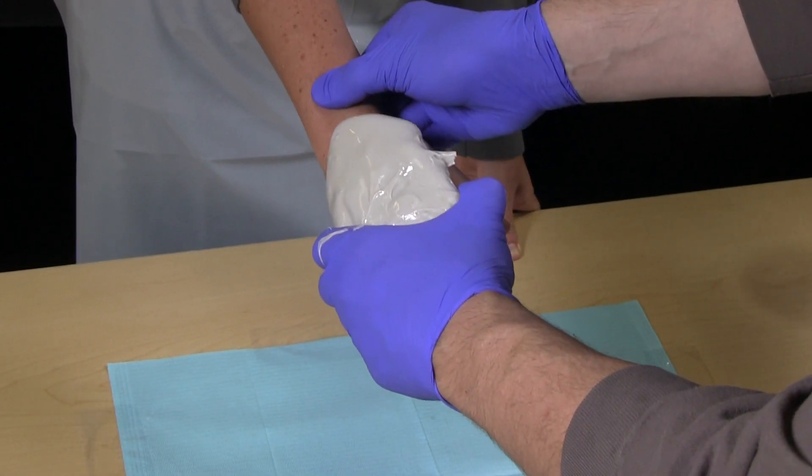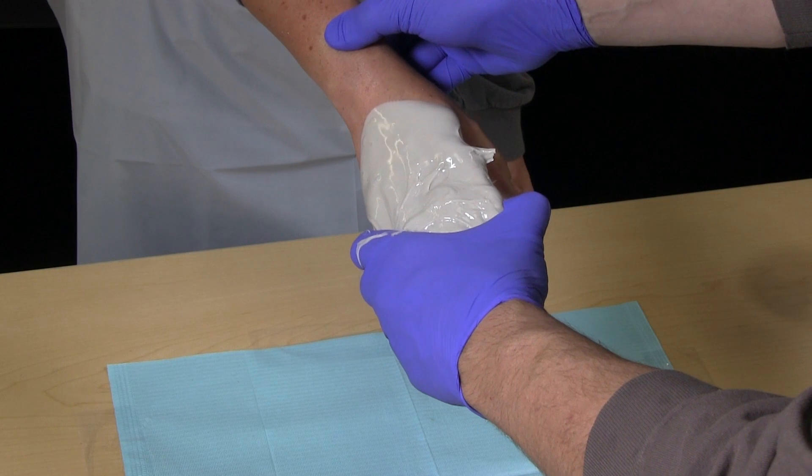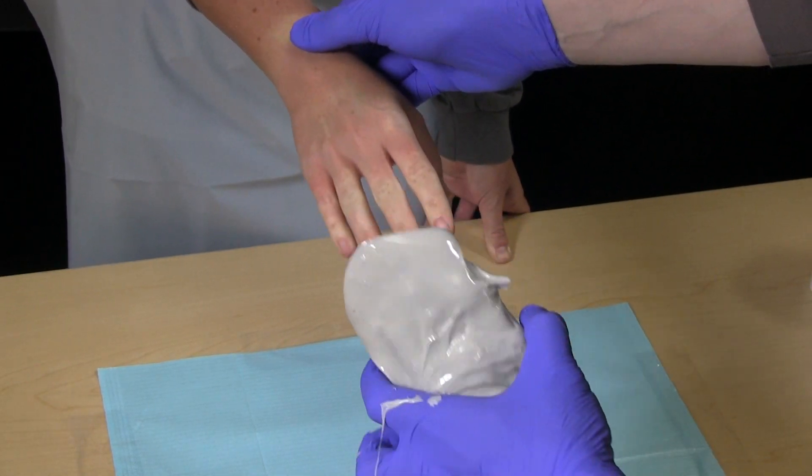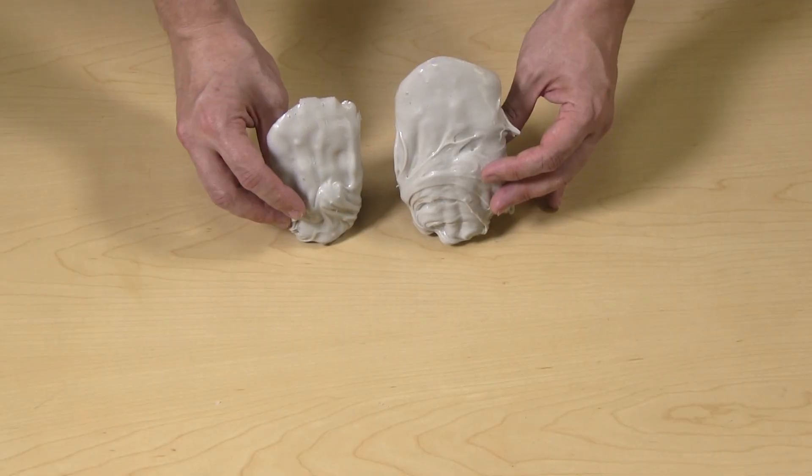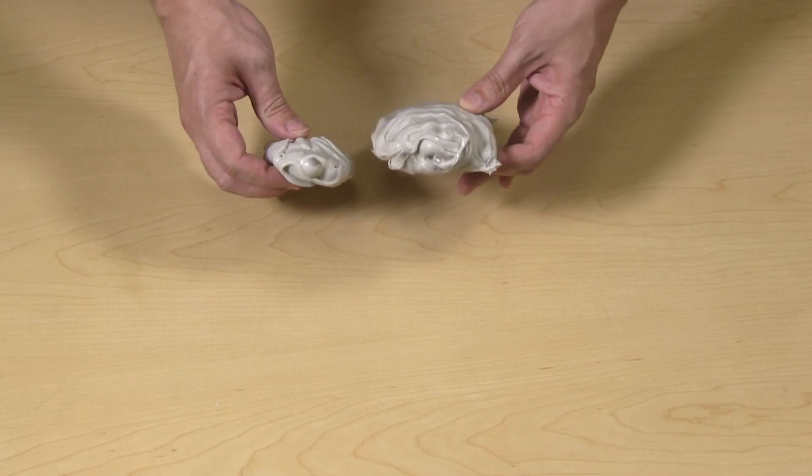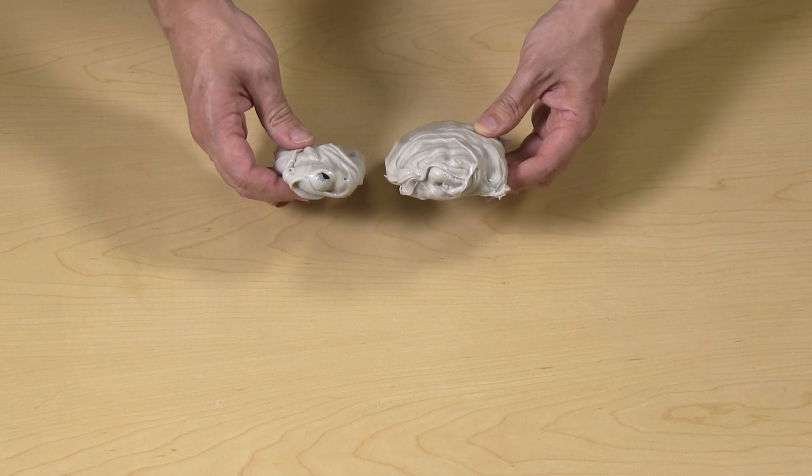When the customer feels ready, with the impression loose around the fingers, firmly grab the impression and slowly pull it off of the customer. Following these steps should result in a full impression with proper pose and appropriate coverage and no thin spots or holes.